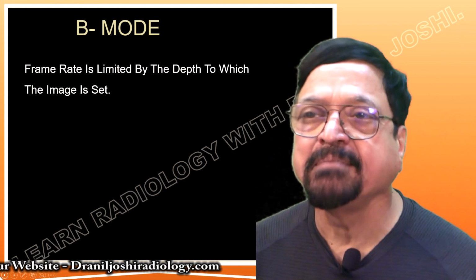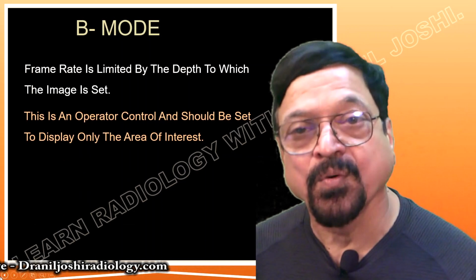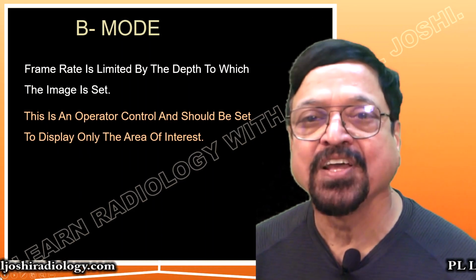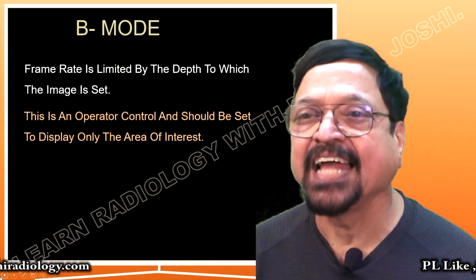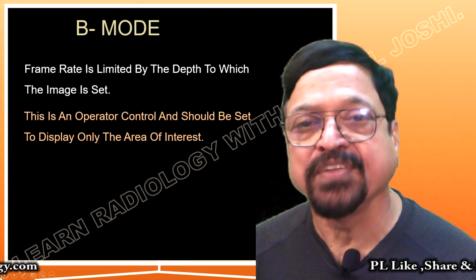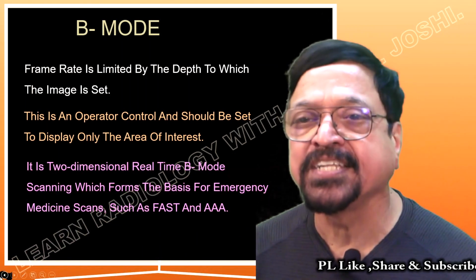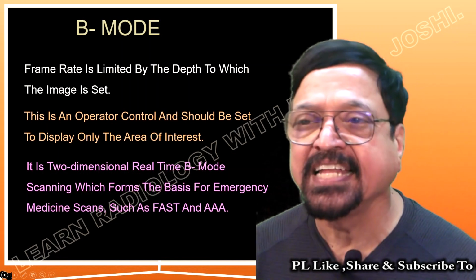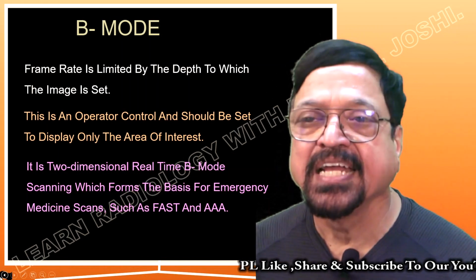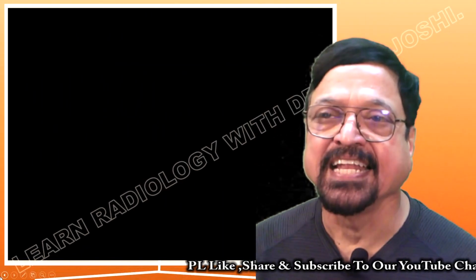Frame rate is limited by the depth at which the image is set. So in other words, you can set a depth and scan in that depth with more detail. This is operator controlled and should be set to display only the area of interest. So depth can be adjusted depending on the operator's requirement. It is two-dimensional, real time, and it is used in basic emergency units of medicine.